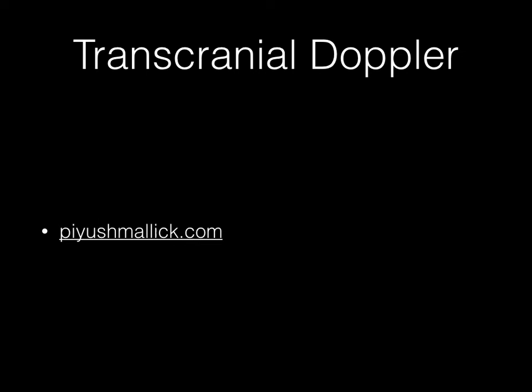Today we'll discuss how to interpret transcranial Doppler. I am not sure any site, paid or free, on the internet till now is allowing you to do this. I don't find it anywhere. So this will be the first transcranial Doppler podcast which is free and it's telling you how to go about it.